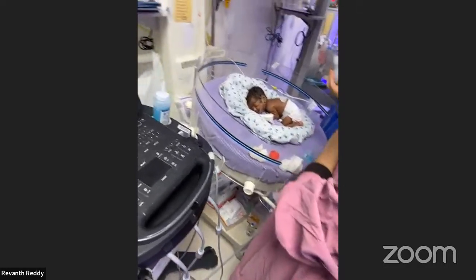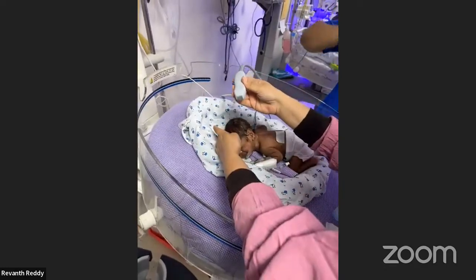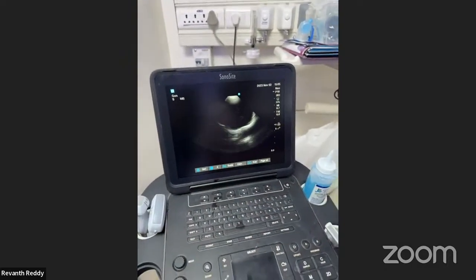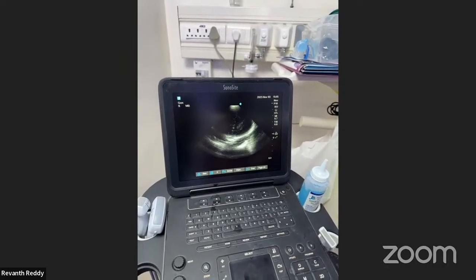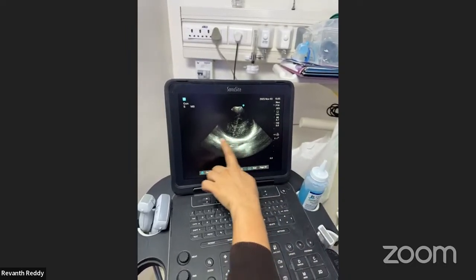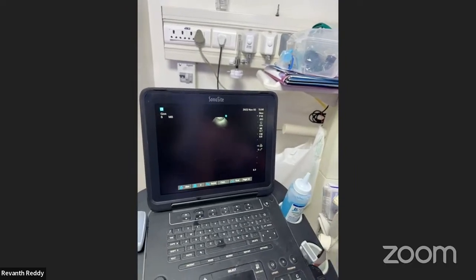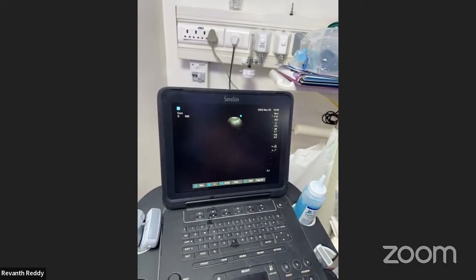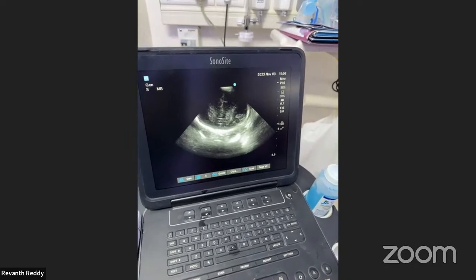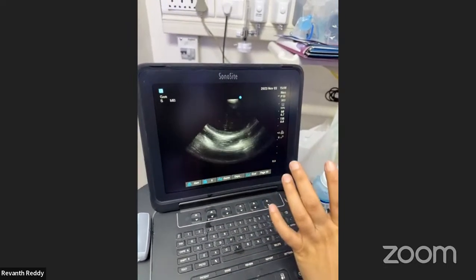So we will see first through the anterior fontanelle, the coronal as well as the sagittal views. In the coronal view, we have to just apply this probe on the AF with the marker towards the right side. Then you can see anteriorly, I'll just show you. The bright hyperechogenic structure is the skull bone, and anterior to that you can see two hypoechoic dots, which are the orbits. Now you can see clearly. This is the bony part, and these are the two orbits. This is the skull bone, and this is the anterior frontal bones, which we have seen in our presentation.